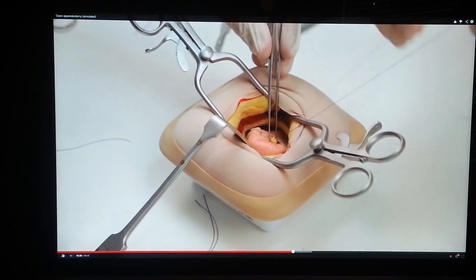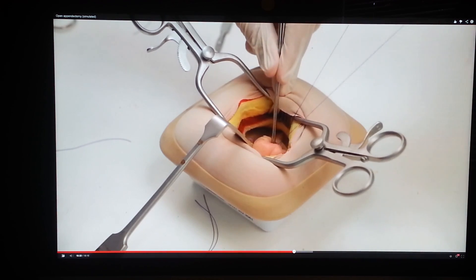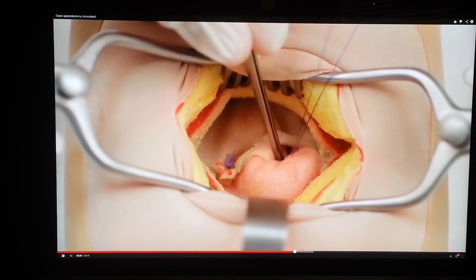Ask your assistant to push the appendix base using non-toothed forceps whilst you tighten the purse-string to bury the stump.